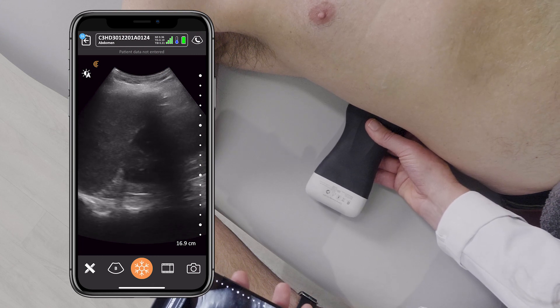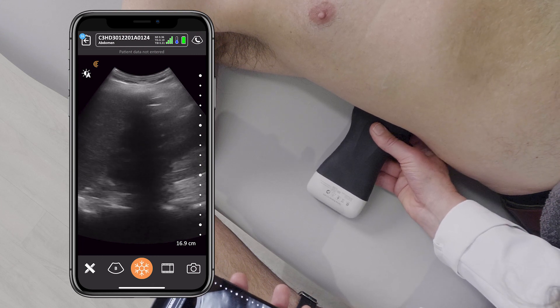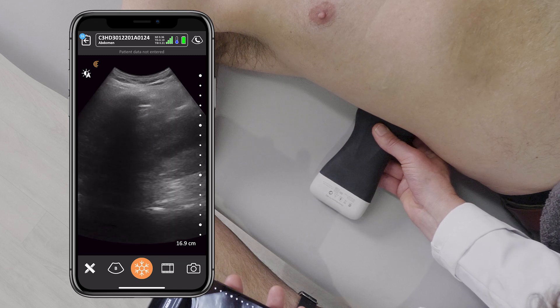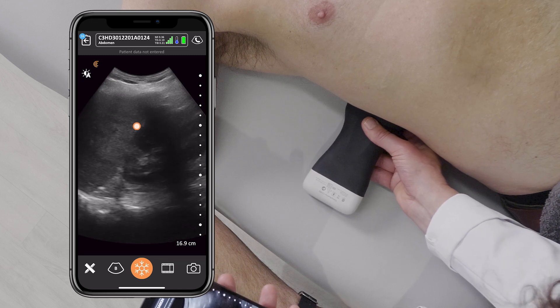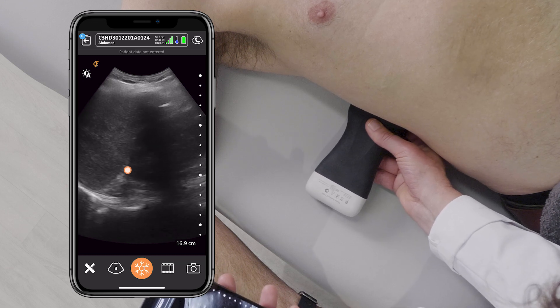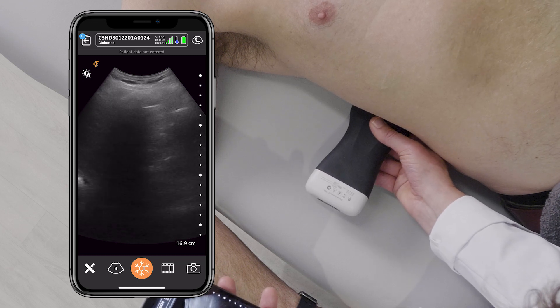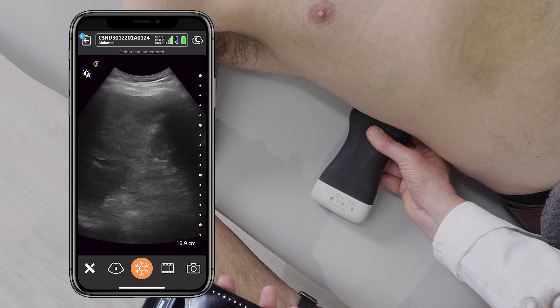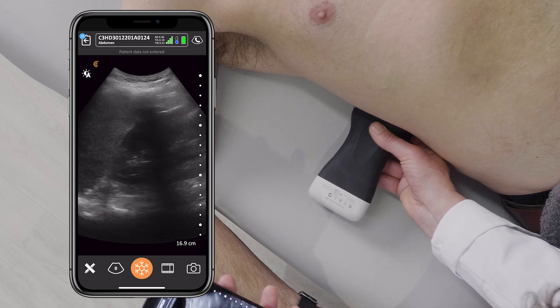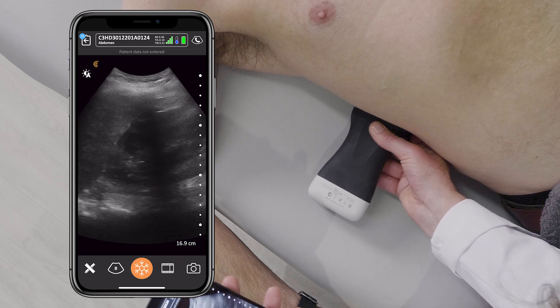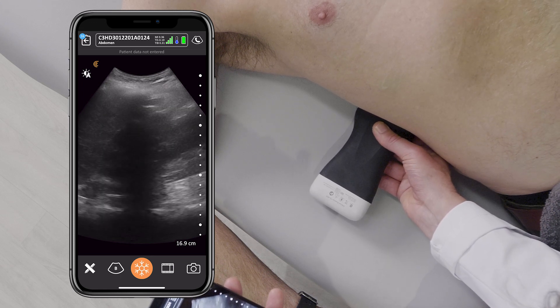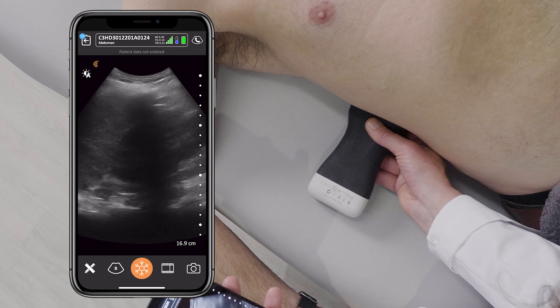You can immediately see the liver and the renal interface. From here, I can sweep through the kidney, and I can assess whether there's dilated calyces or a dilated pelvis.